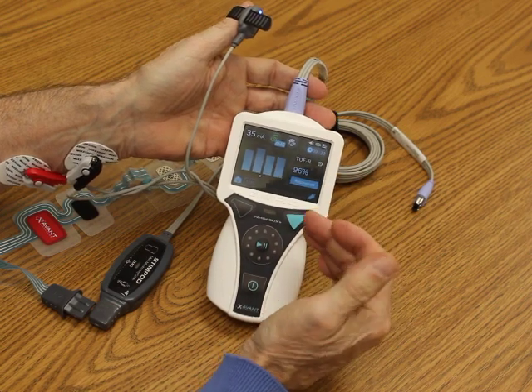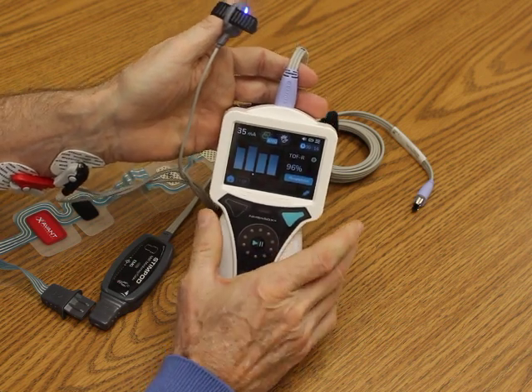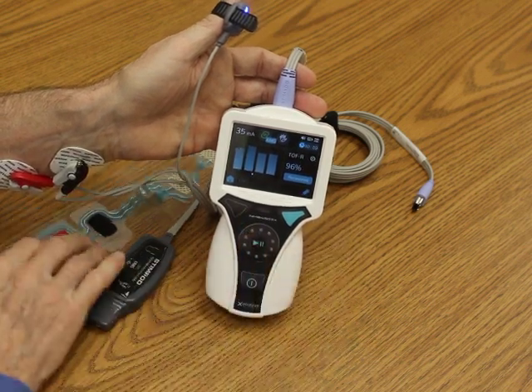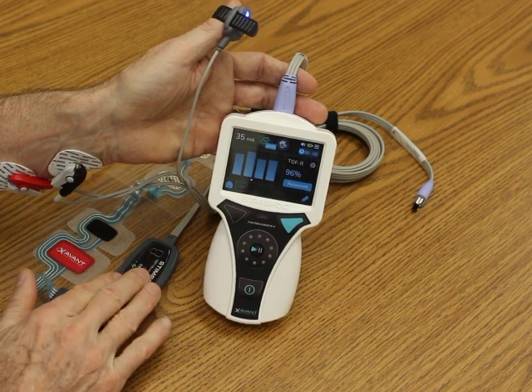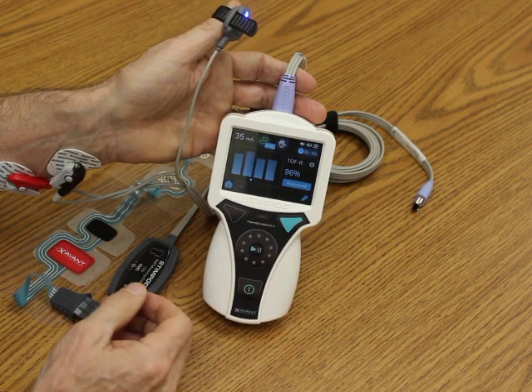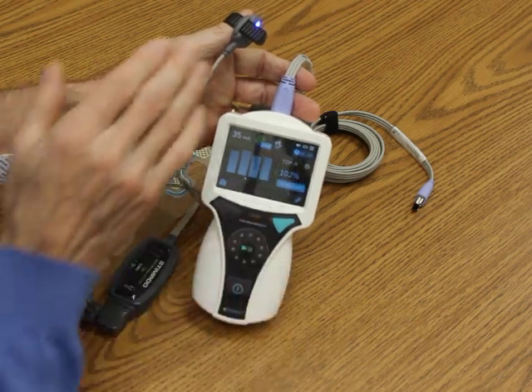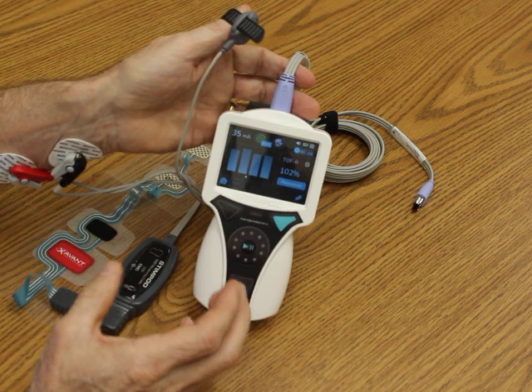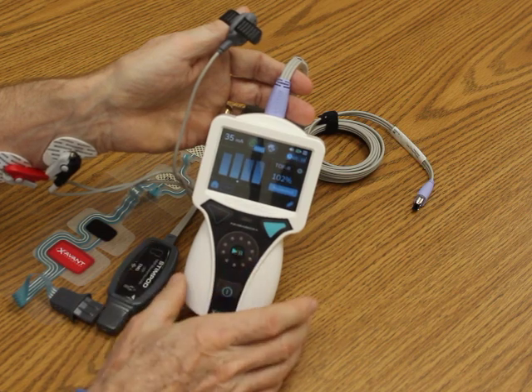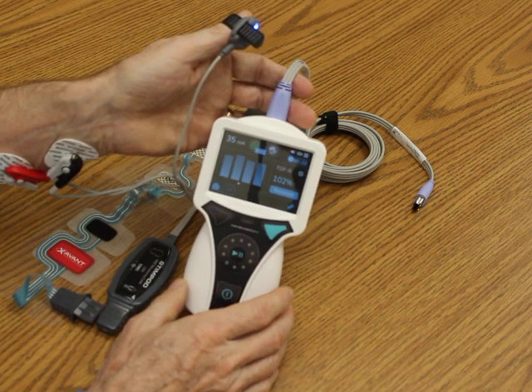A patient that is over 90% would be safe to extubate. The Stimpod 450X Plus is available with a universal IV pole mount that allows you to adjust it in many different ways. The EMG cable is available in an 11.5-foot length, which is excellent for robotics and closed-hand systems. I'm at 102%, so once again it's a fifth-generation accelerometer and it's extremely accurate. Please call Bell Medical to allow us to give you a free trial, an evaluation, or at least a Zoom call to review the benefits of the Stimpod. Thank you.